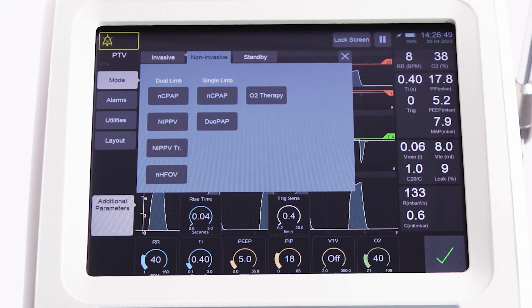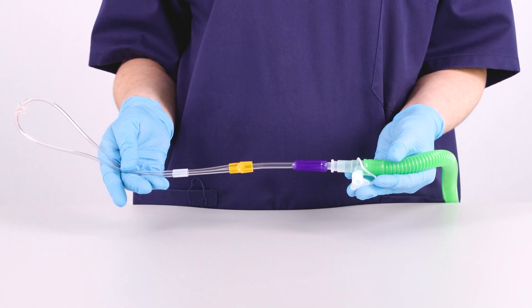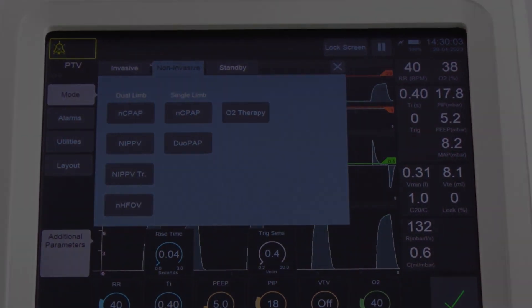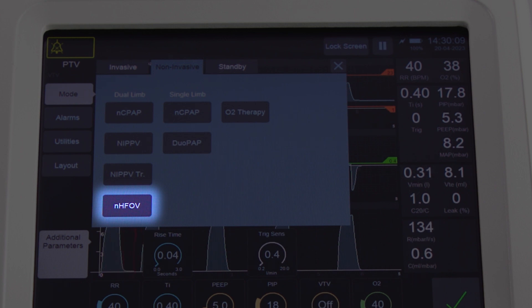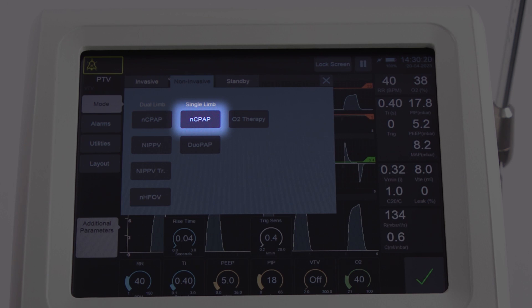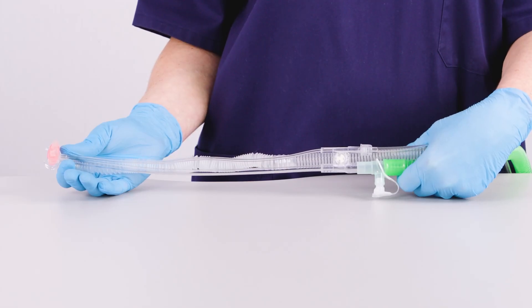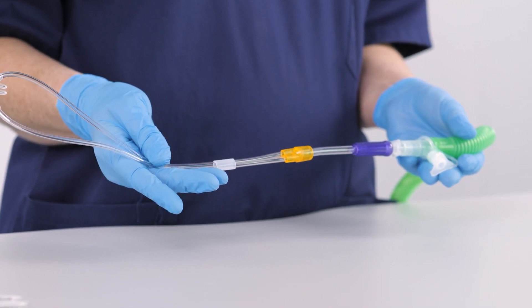All non-invasive modes including oxygen therapy can be applied by simply adapting the SLE6000 patient circuit and using the appropriate patient interface for that mode. Nasal CPAP, NIPPV, triggered NIPPV, and nasal high-frequency oscillatory ventilation can be used with a dual-limb patient circuit configuration using the SLE mini-flow adapter. Nasal CPAP and DUO-PAP modes can be used with a single-limb circuit configuration using First Breath, Inspire, or other nasal CPAP generators. Oxygen therapy can be used with the nasal cannulas supplied by SLE.